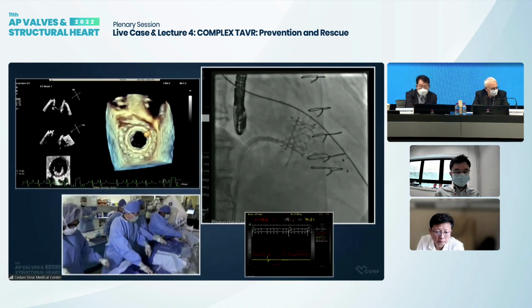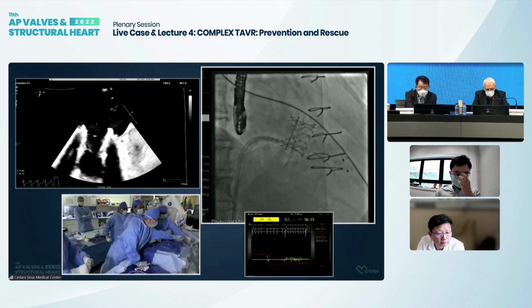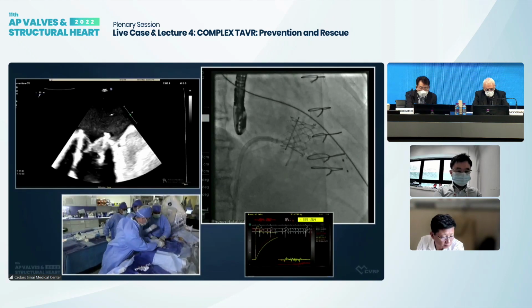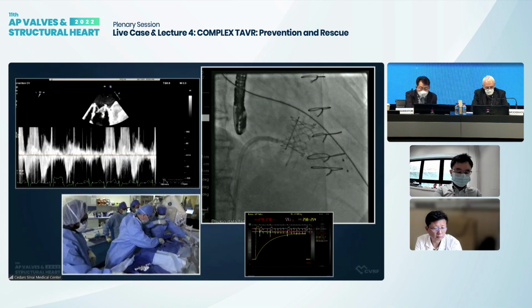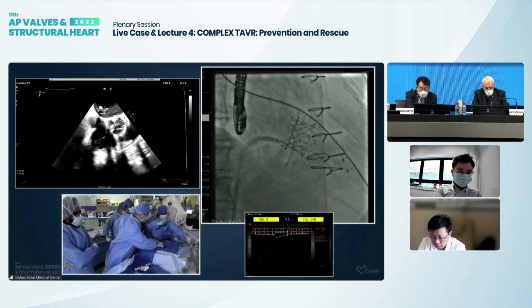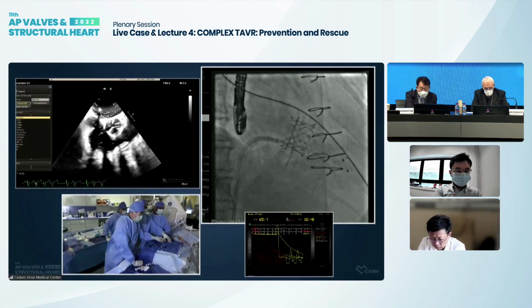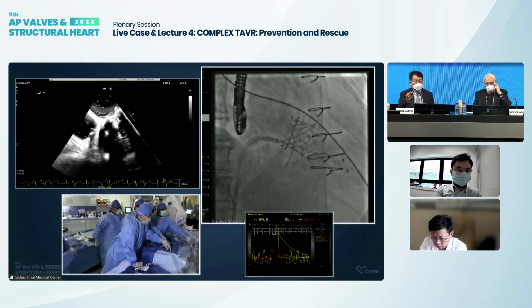So we will use this, which is the multipurpose catheter, which is across the valve in the left ventricle, and the Agilis catheter. Just like when we first got the hemodynamics, we had the pigtail catheter and the Agilis, and now we have this. So that'll give us the hemodynamics. Now, did we see any PV leak? I didn't see any, right? I can see it. So there are no surprises. There's some air in the atrium.